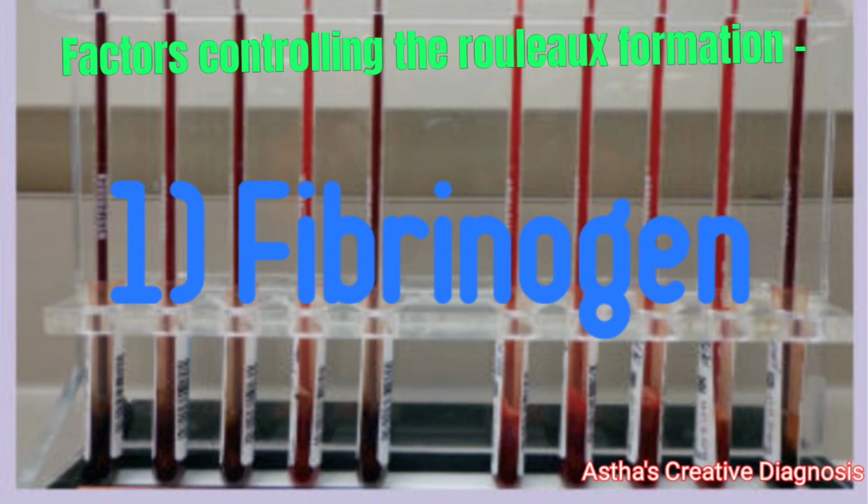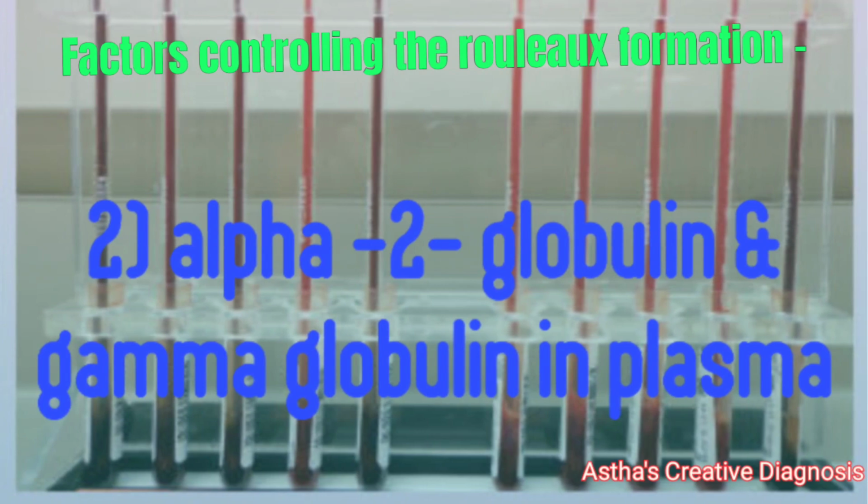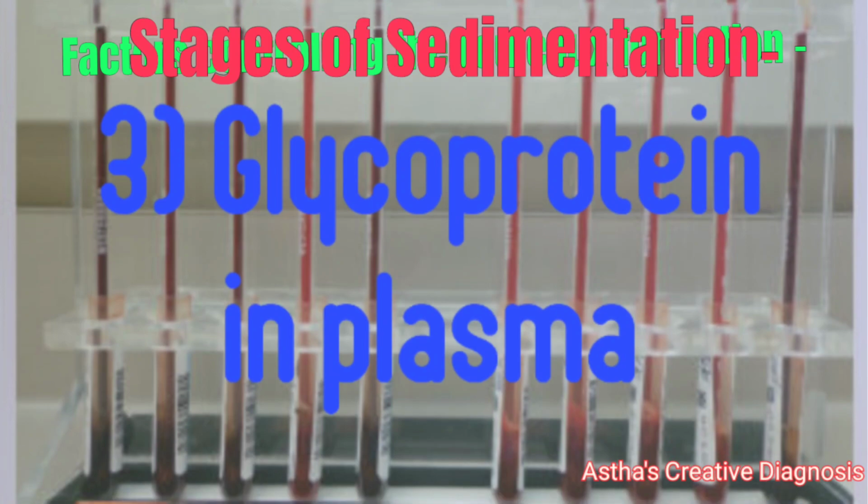Factors controlling the rouleaux formation: number 1, fibrinogen. Number 2, alpha 2 globulin and gamma globulin in plasma. Number 3, glycoprotein in plasma.